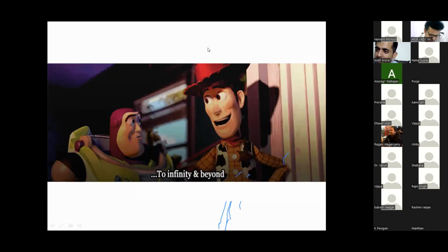Okay. In cases of wisdom teeth, you can create a purchase point just below the CEJ, that is 2 to 3 mm below the CEJ, or if it is an impacted tooth, you can go below the circumferential area, the maximum circumference. At the same time, it's a misconception among dentists that a fulcrum needs to be fixed at one point. अगर आप टूथ निकाल रहे हो, टूथ निकालने के साथ साथ पोजीशन पे टूथ भी हिल रहा है.